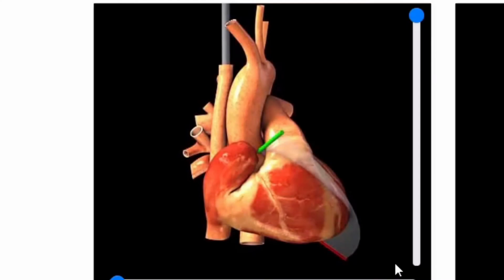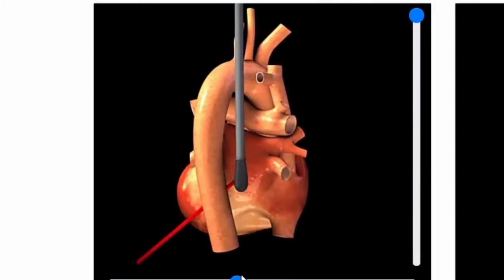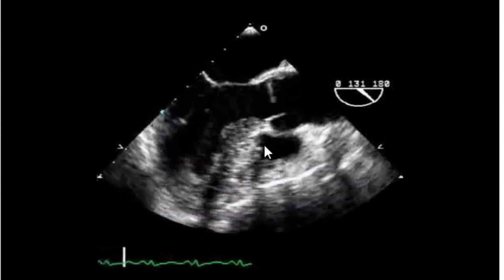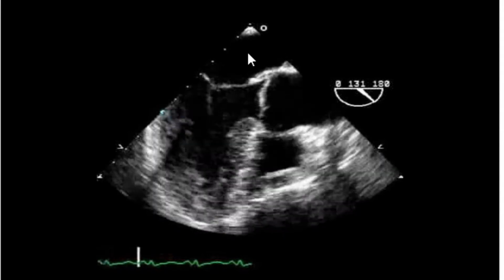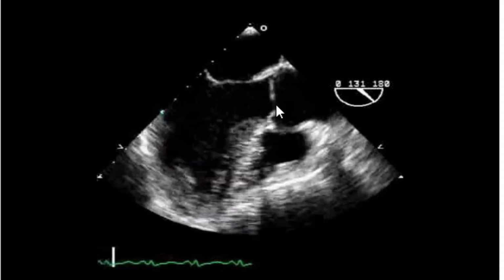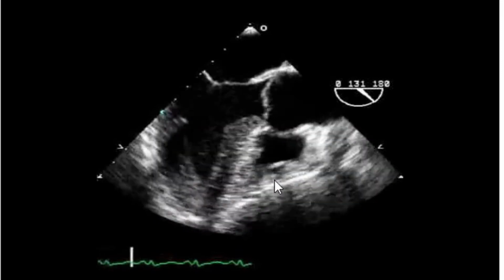In this mid-esophageal long axis view, you can see that the plane of the beam has changed. The location of the probe continues to be mid-esophageal. And with this view, you're looking at predominantly the left ventricle. This is almost, again, similar to the PLAX view in transthoracic echo, where you're seeing the left atrium, the mitral valve, the left ventricular cavity, left ventricular outflow tract, that's the aortic valve, root of aorta and ascending aorta, and a small part of the RVOT.